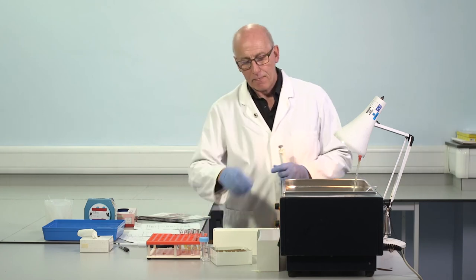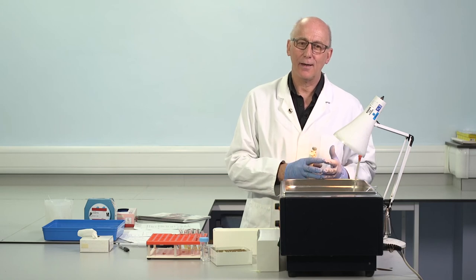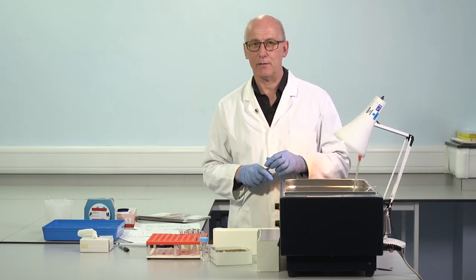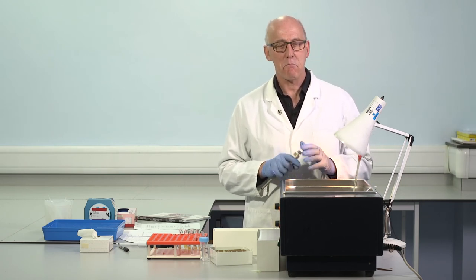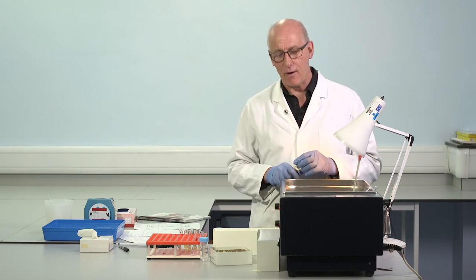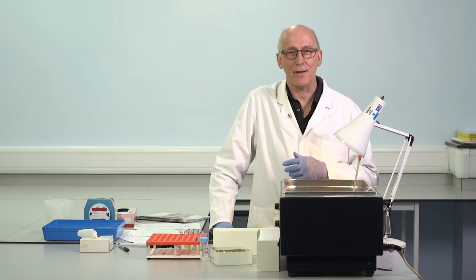Okay, warming up. So the phospholipid concentration has an important effect on the results which we'll obtain. The phospholipid concentration and profile has the biggest impact on results in the presence of lupus anticoagulant. Lupus anticoagulant patients are extremely heterogeneous. There are many, many different antibodies, very frequently unique in a patient, so really quite different between different patients. And so probably it's not a surprise that the impact of these antibodies is very different according to the phospholipids present in different APTT reagents.